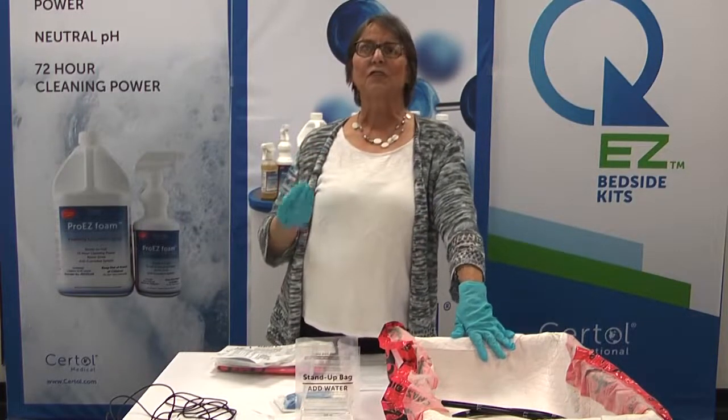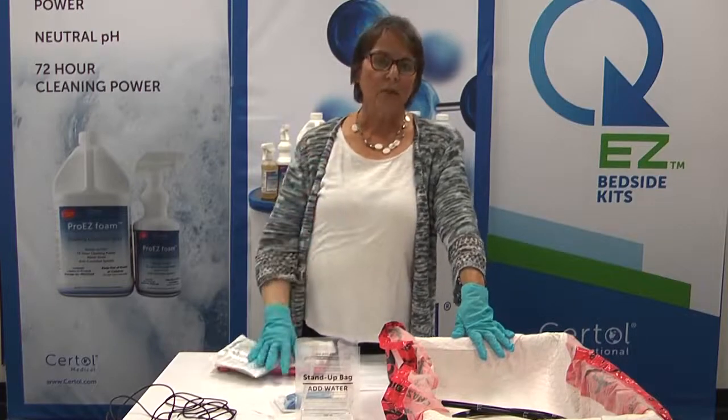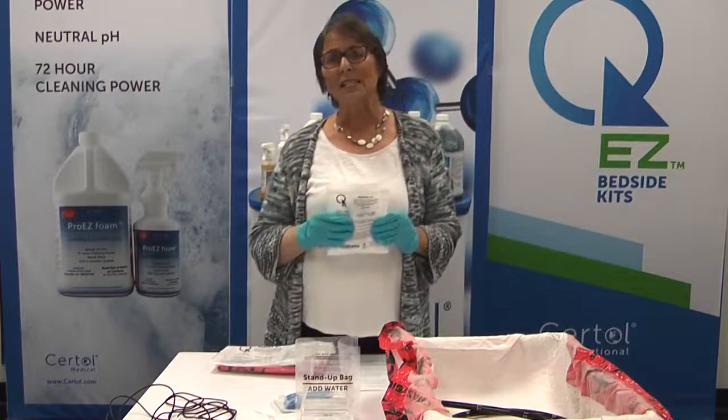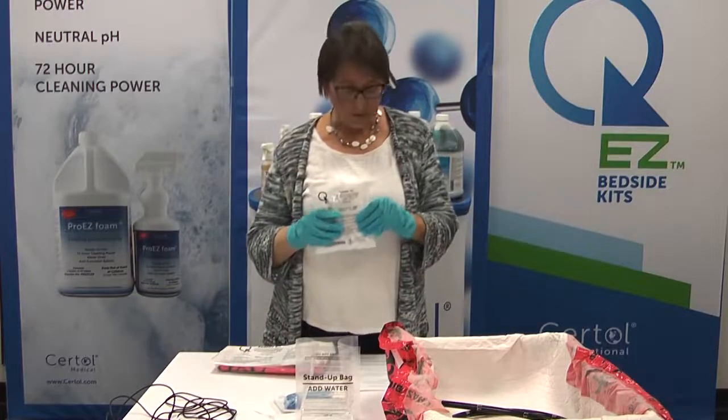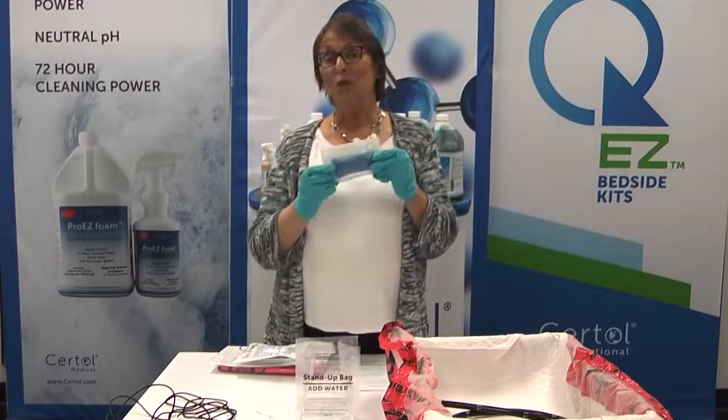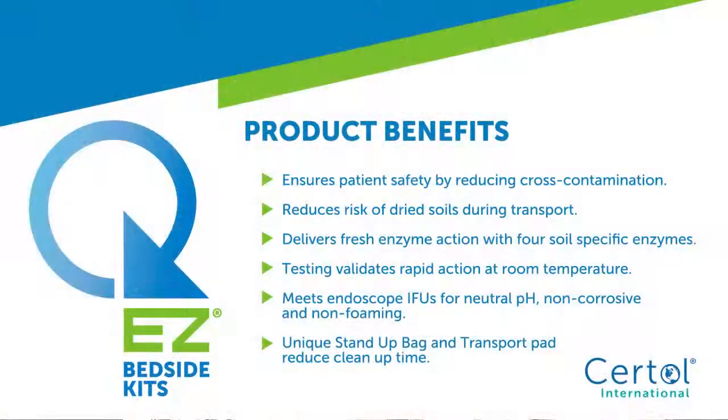What are the essential features for this type of product for bedside cleaning? Definitely the product needs to be easy to use. It needs to have an effective cleaning agent — we have ProEasy AW Quad, a four-enzyme detergent inside these pre-saturated sponges. The four unique enzymes — protease, amylase, lipase, and cellulase — work together to attack the soils inside your endoscopes.